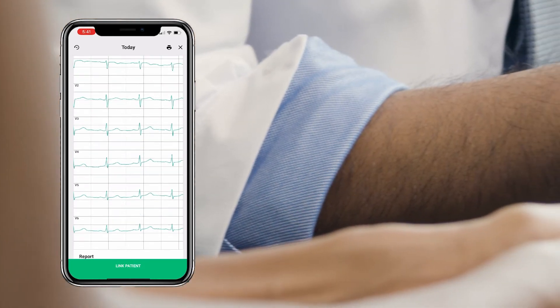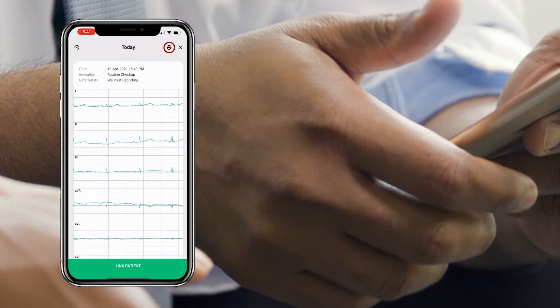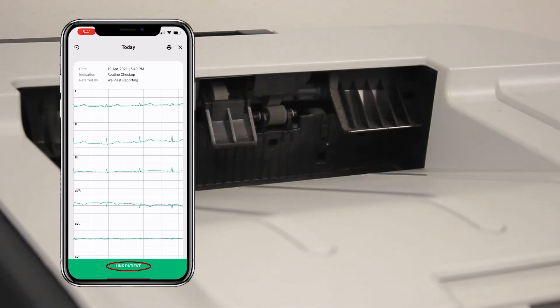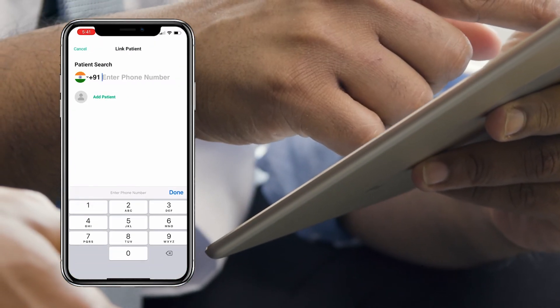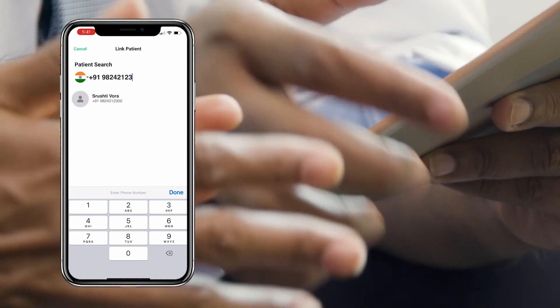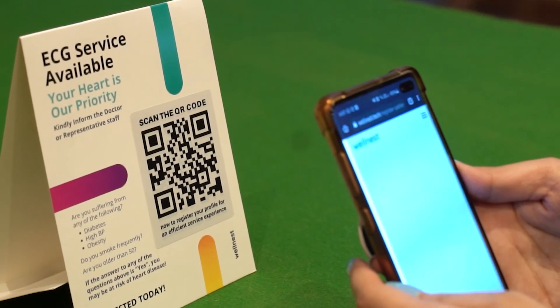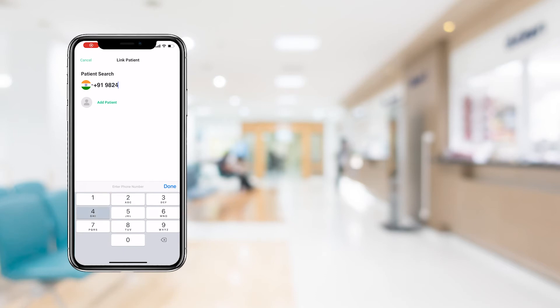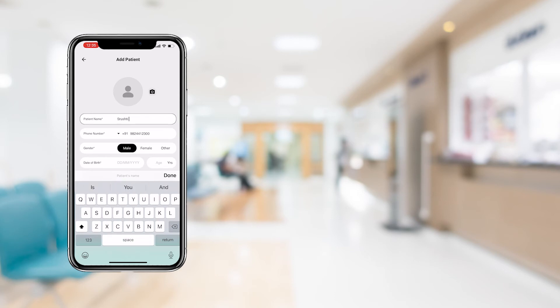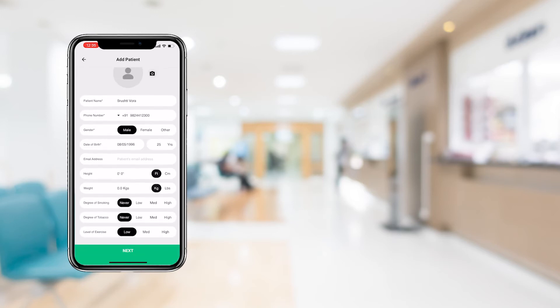In case of emergencies, you may choose to print out the ECG report right away via a Wi-Fi printer by clicking on the print icon. Otherwise, you should link the patient using their phone number. If the patient is already in the directory, their profile should appear. The patient will be part of the directory if their profile has been created with Wellness, either by a staff member during a previous visit or by themselves using the QR code on the patient standee, which is recommended to be placed in your waiting area. If the patient is not part of the directory, the staff member can create their profile on the app right away with some basic information. After authentication, either via their age or an OTP, the ECG will be saved to their profile.